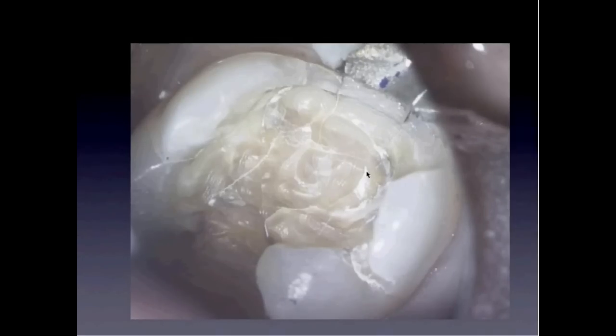Or here, a lady came with a constant pain in her lower 6 on the right side, and it had just a very big old amalgam filling, which was removed. And after removing it, we could see that there were a lot of cracks in the tooth. Fixing it with a composite filling for some time as a temporary solution, the pain was gone, and we'll wait for about half a year to decide if she should get a crown or not.